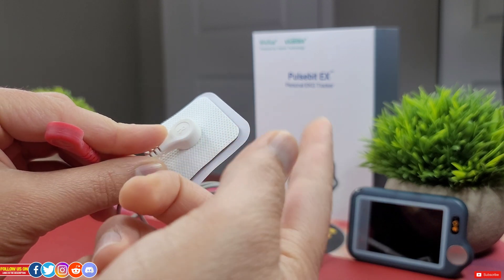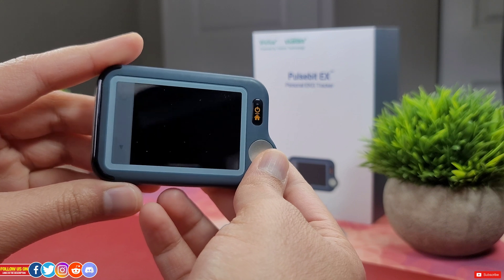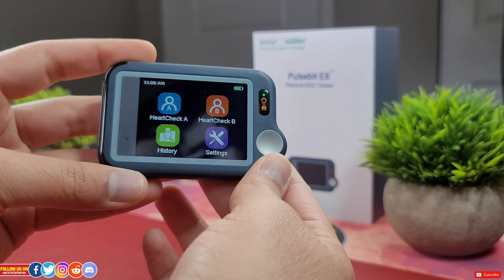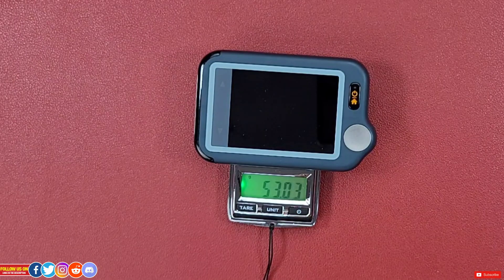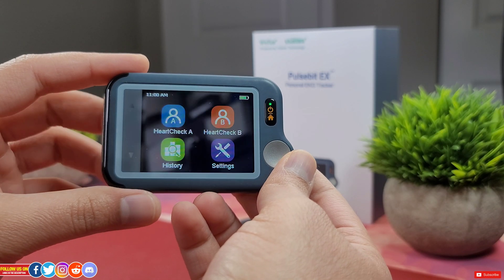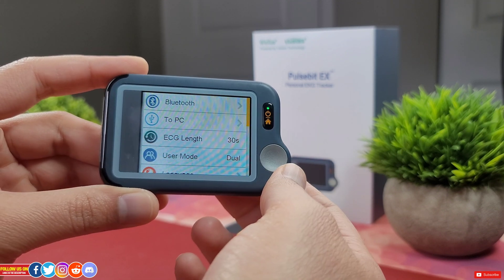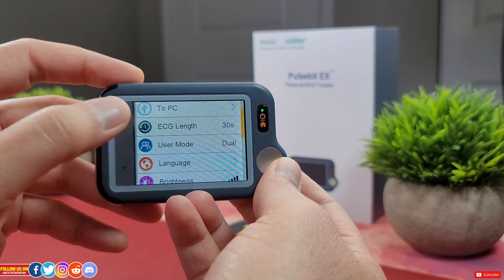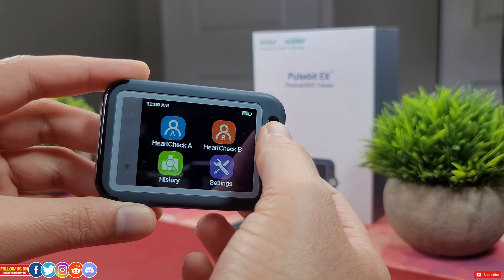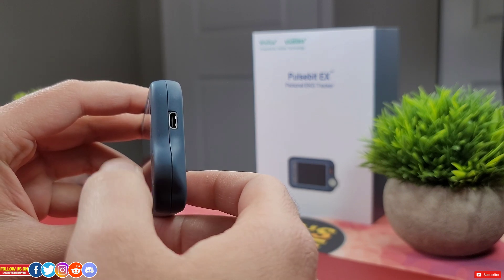Now let's talk about the Pulsebit EX unit itself. The first thing I noticed is how strikingly lightweight it is — it only weighs about 53 grams. The overall design is sleek and functional. There is a 2.4-inch touchscreen color backlit display with two tactile buttons. There's an on/off button which also exits to the main menu, and that is the only button on the device. On the side there is a micro USB connection port used for charging, attaching the ECG cable, and data transfer to a PC.